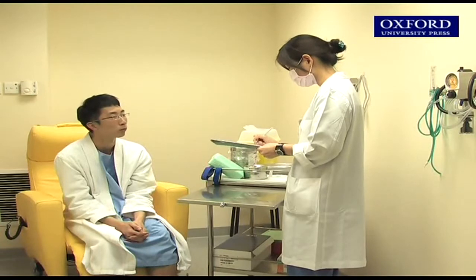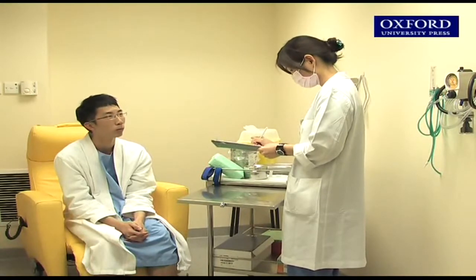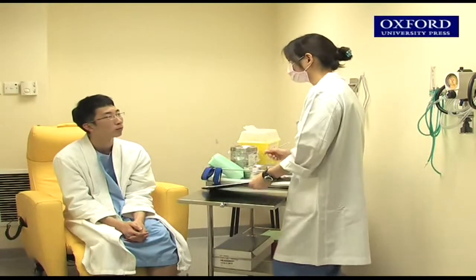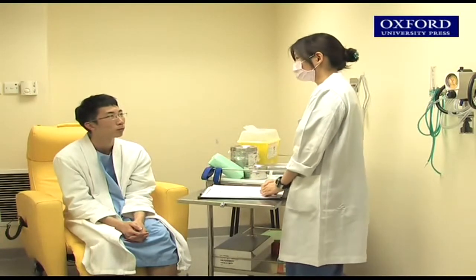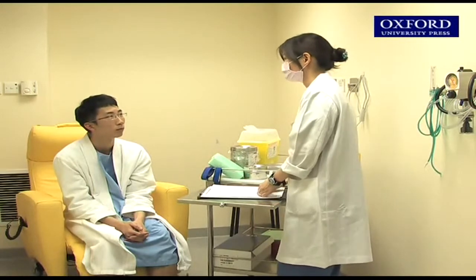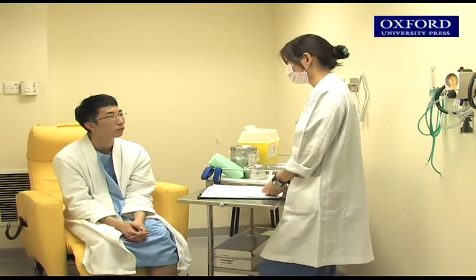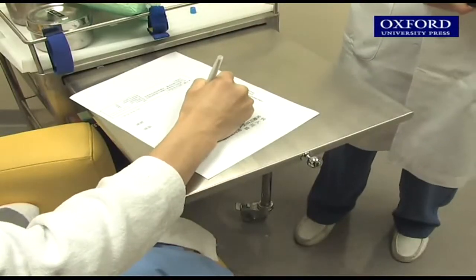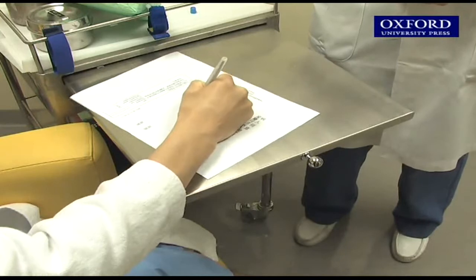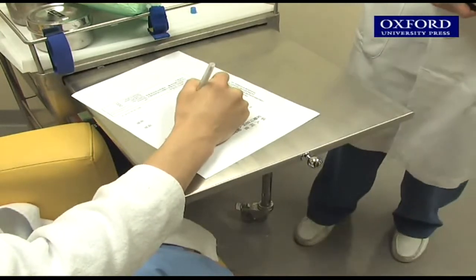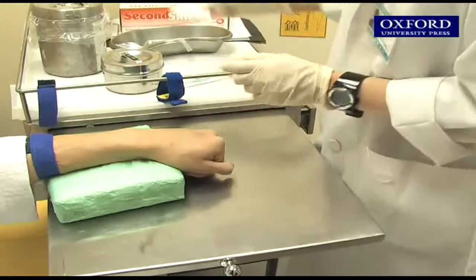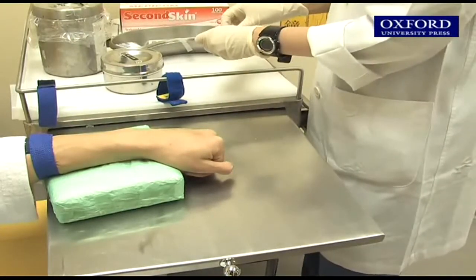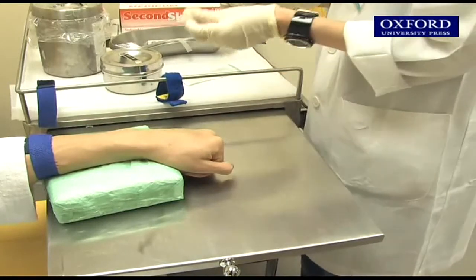Before the radionuclide imaging examination, the nurse will verify the patient's identity, confirm his or her health situation, explain the risks, and the process of the examination. The patient must sign a letter of consent before taking the examination. The nurse will insert a needle in a vein on the patient for later injection of radioisotope tracer.